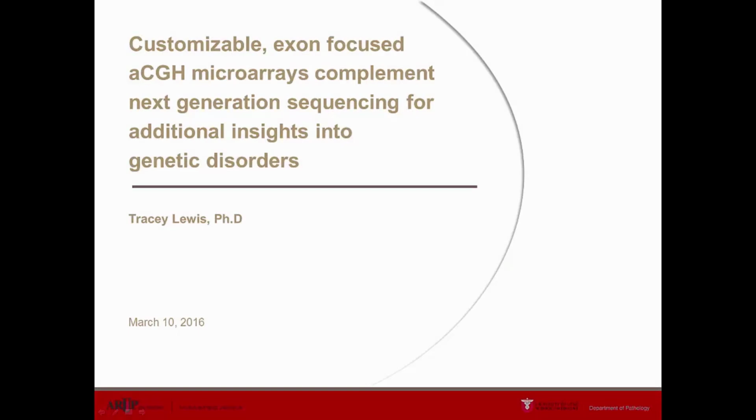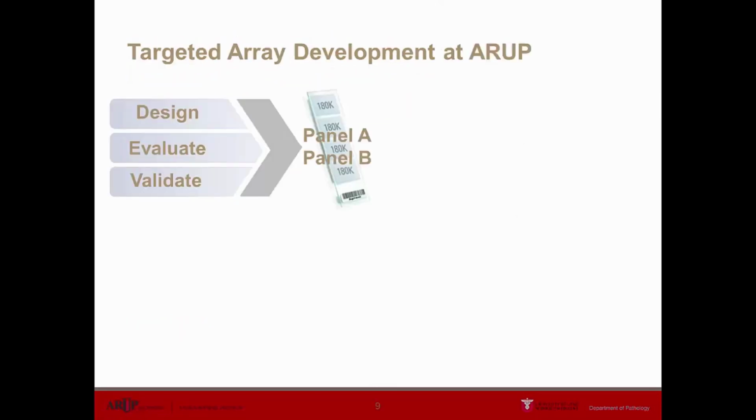Okay, thank you. I wanted to talk about our use of custom arrays in the lab to complement our NGS testing and how we've used the medical research exome array. We've had arrays in the lab for quite a few years, and our process initially had always been to design the array for the content we want for the specific gene panels, then evaluate that design, and then validate it.